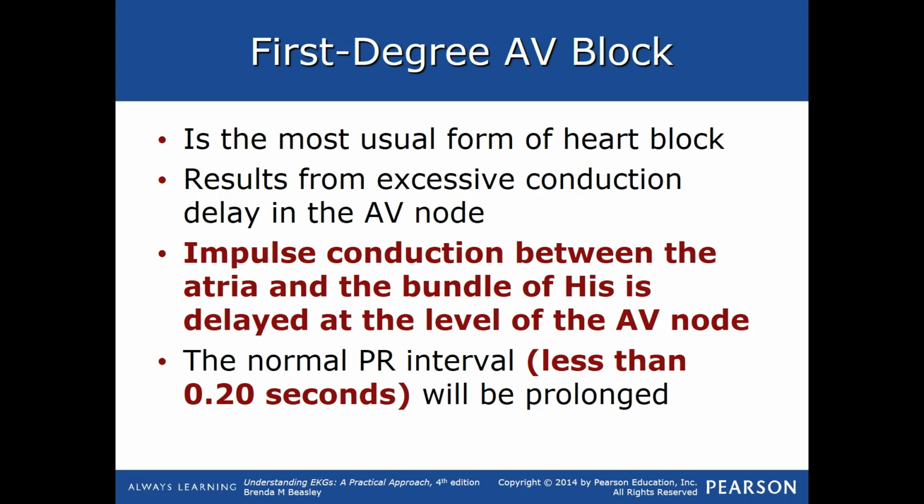So, starting off, first degree AV block. This is the most usual form. Most people are unaware that they even have this. They're not complaining of anything. I had a friend who was a marathon runner, and we did an EKG on him when we were in paramedic class. Turned out he had a first degree block. He went and saw somebody. The docs were not concerned about it at all. It had never caused him a problem. So this is just one of the most usual forms.